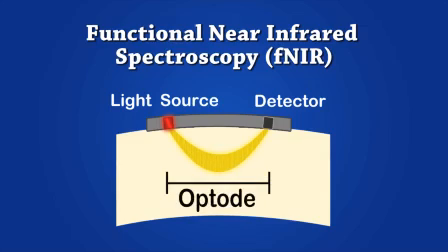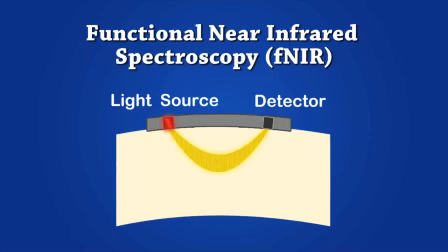The depth of the penetration, in other words, the curvature of the banana, is a function of the distance between the light source and detector. That's why fNIR sensor geometry is key in the design depending on the type of measurements. For cognitive tasks and measurement from the prefrontal cortex, optode separation is usually 2.5 centimeters to 3 centimeters.